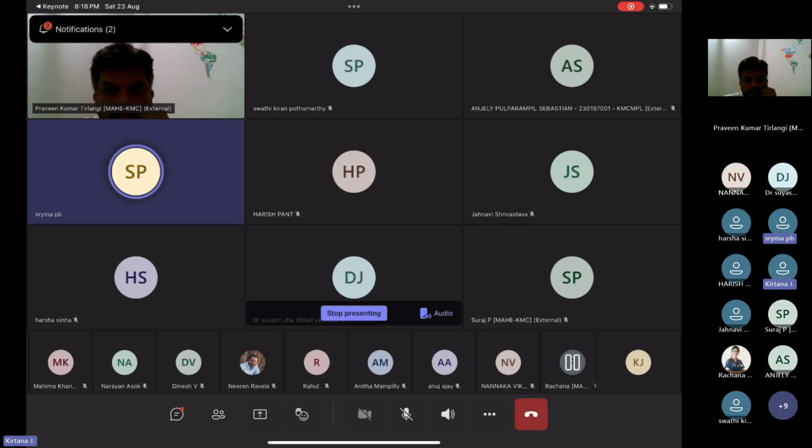That website which I talked about, the RT Maven one, has videos on how you can do it on a Servo ventilator as well, Maquet, as well as everything. But the only thing is that the patient has to be passive. So it is all applicable in a paralyzed patient. That is one thing which I wanted to add.